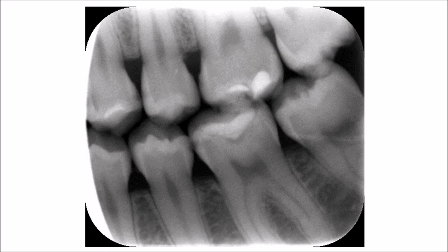On this bitewing radiograph covering the premolars and molars, I want you to look at the upper first molar. You will see there are two fillings, mostly on the occlusal surface. Have a look at the area on the mesial filling — this area you will notice shows something of interest.